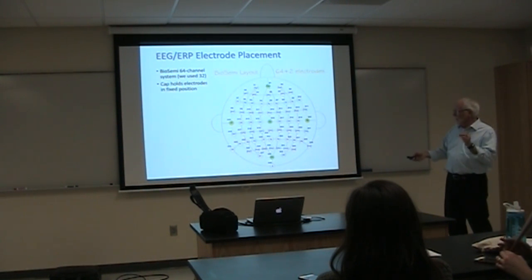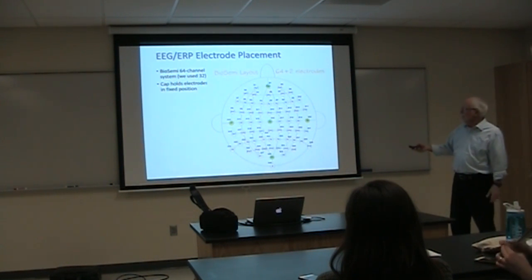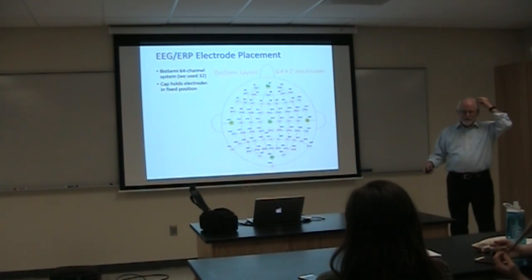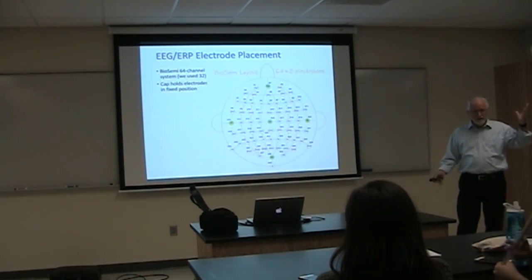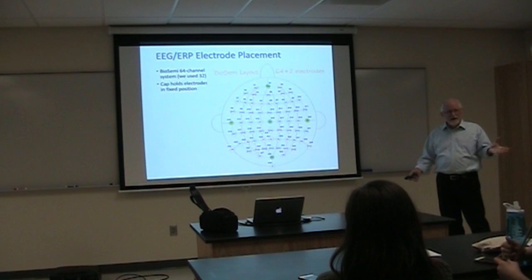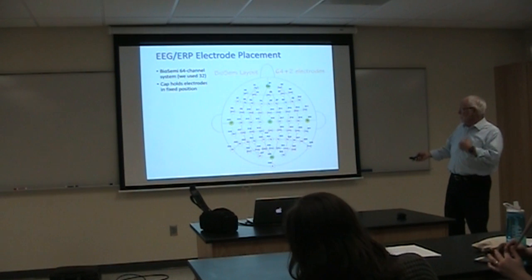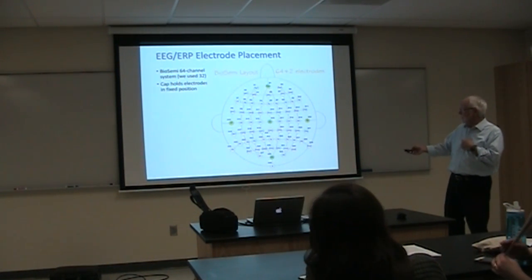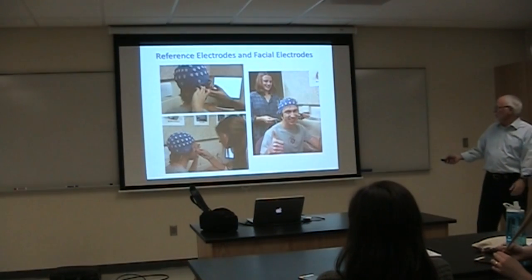And so when I've looked at which of these electrodes is actually showing the N400 most strongly, it tends to be, for some people, this CP3 or C3 or FC3. This is kind of over the left temporal area near the auditory area and also what we would call Wernicke's area, which is responsible for the interpretation of spoken language or written language. Okay, so I'm going to show you down the center line, but just realize that if we had picked the electrodes on the left side, we might get an even stronger effect.